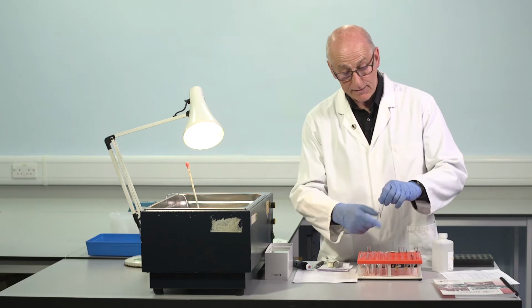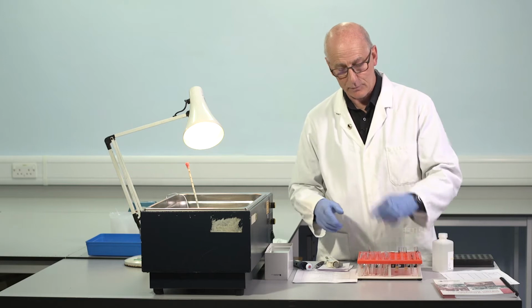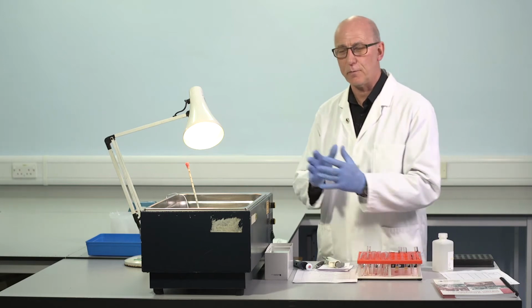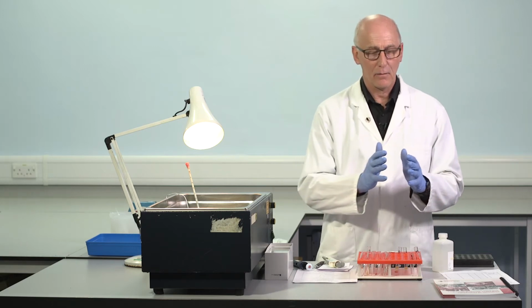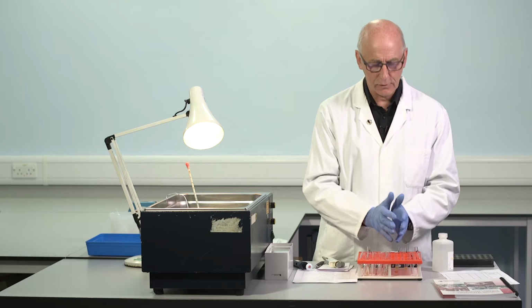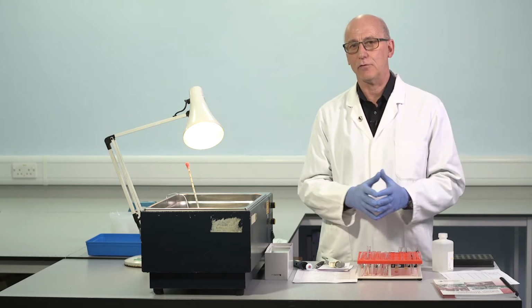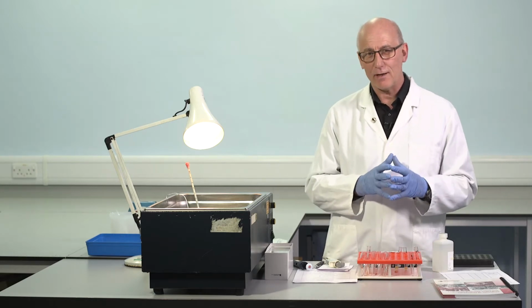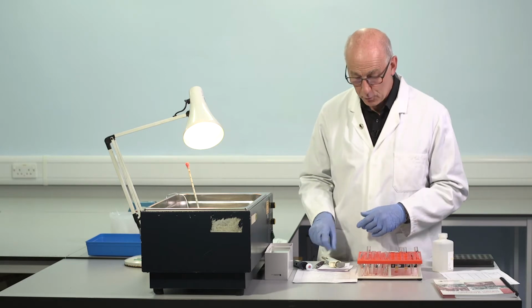In a moment we'll be testing a quality control sample and some patient samples. We should not prepare those dilutions until just before we make the test. So we prepare the standard, make the test. Prepare the IQC, make the test, and so on. That way, the interval between preparation of dilutions and obtaining the clotting times is the same, and we should always be trying to treat the standard and the QC and patient samples in the same way. It's really important to do that.